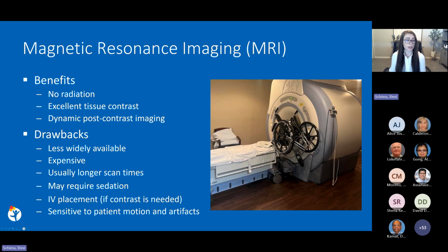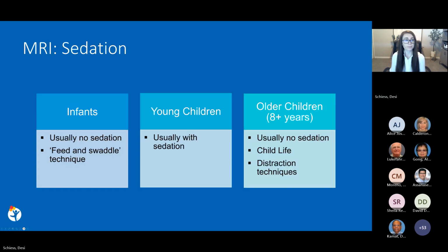Artifacts can also be seen in MRI due to various factors including motion, electrical interference, or certain materials in the body such as metal, gas, or surgical changes. Metal suppression techniques can be applied in patients with orthopedic hardware to improve image quality. If the degree of artifact precludes diagnostic evaluation of the anatomy of interest, it is not worth performing the MRI, which may be the case with dental braces and brain MRI.